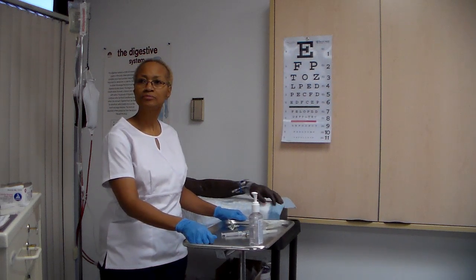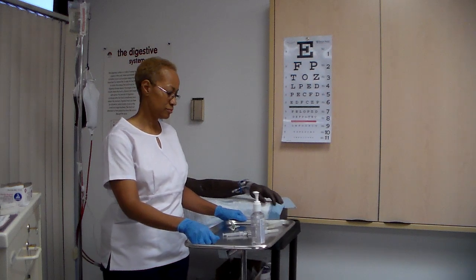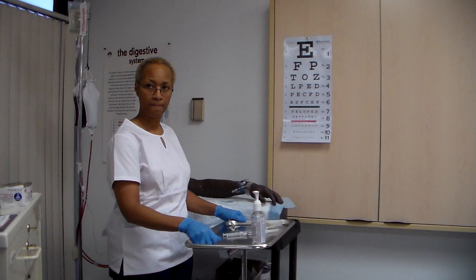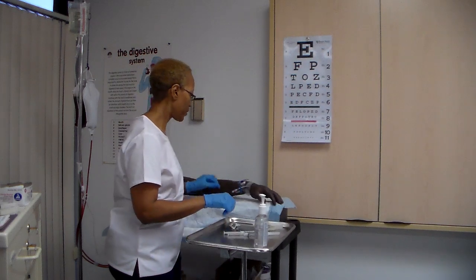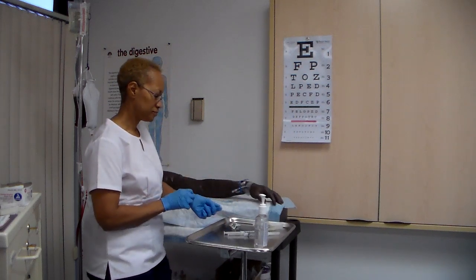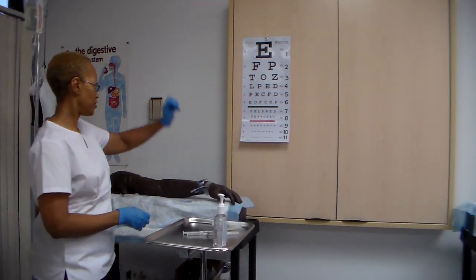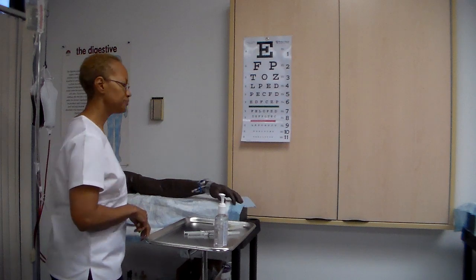Okay? Dispose of uncapped needles and syringes in puncture-proof and leak-proof container. Remove and dispose of gloves. Perform hand hygiene. Okay. Check my site. My client has a biohazard container in the room, so I would dispose of that. Or if not, I would bring in a biohazard container with me. Okay.